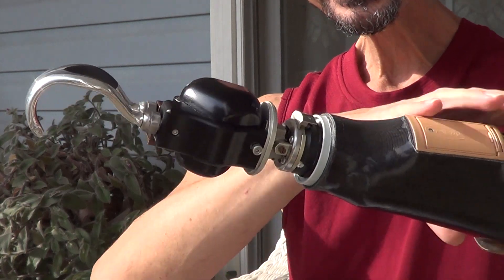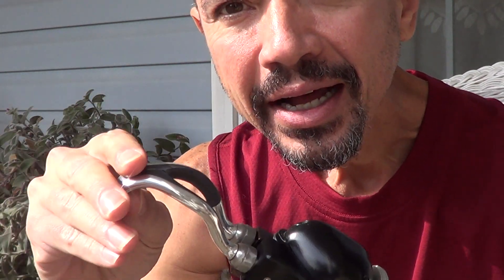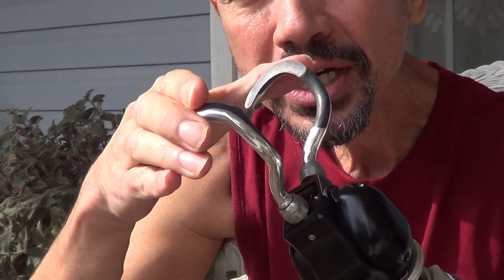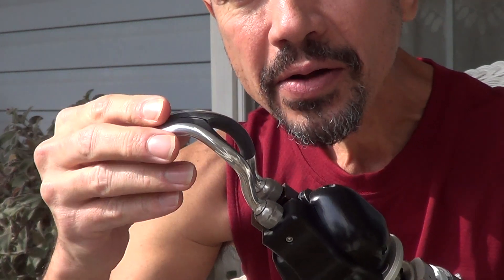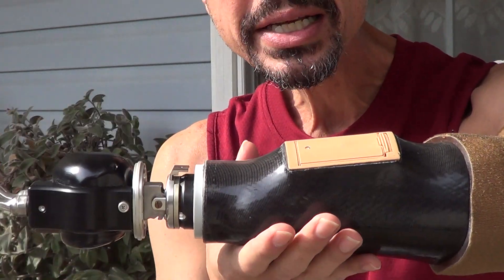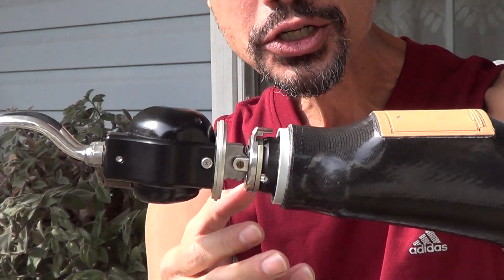It's pretty cool, isn't it? I'm real happy with it. The pinch on it has 25 pounds of pressure, so I have to be very careful with it. And the whole prosthesis weighs about 5 pounds, like a bag of sugar.